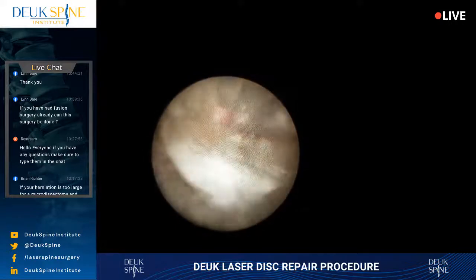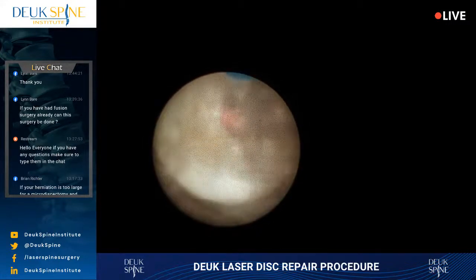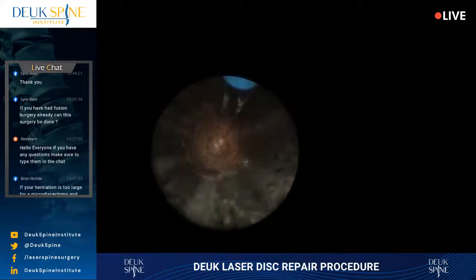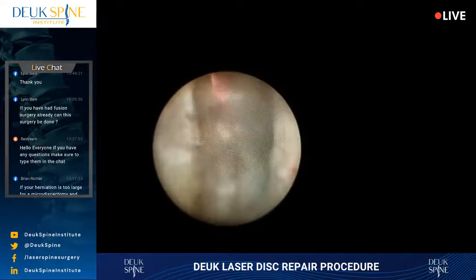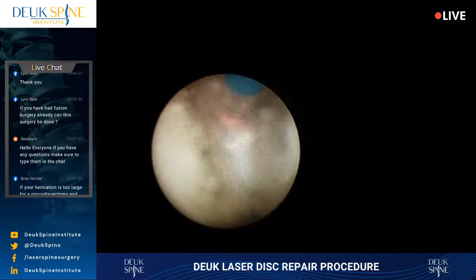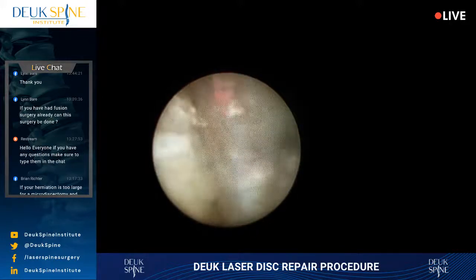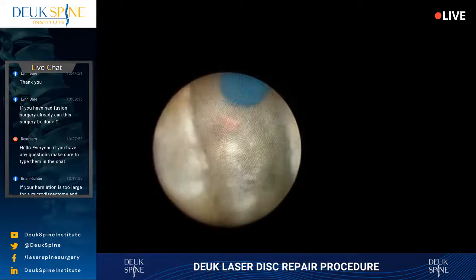All right, we're just about done here at this level. I want to look a little bit more. Now, our job is not to decalcify the posterior ligament. Our job is to get rid of her pain and decompress the spinal cord and nerves. So, you don't want to get too cute and gild the lily. There's definitely an opportunity to get a little bit more of this stuff out safely. But it is stuck down. So we just have to be really careful now.